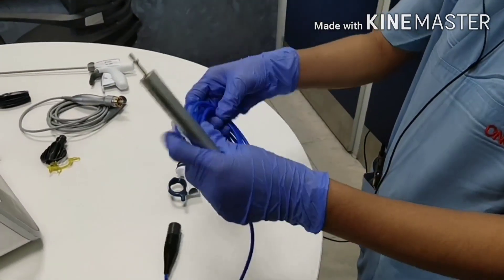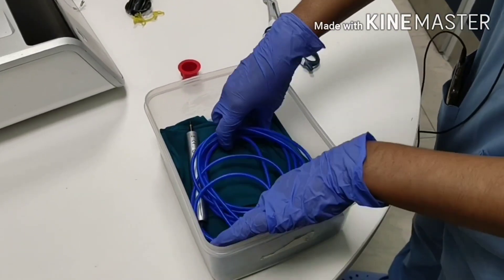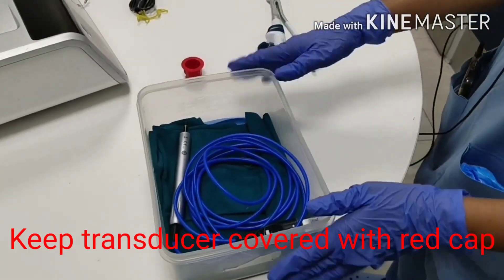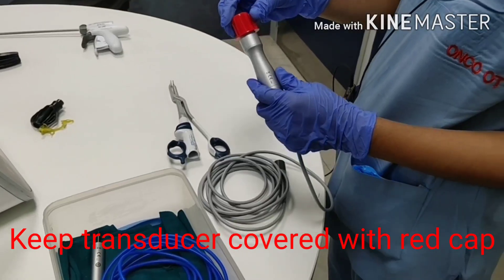After use, keep the transducer like this only and cover with the red cap to protect it.